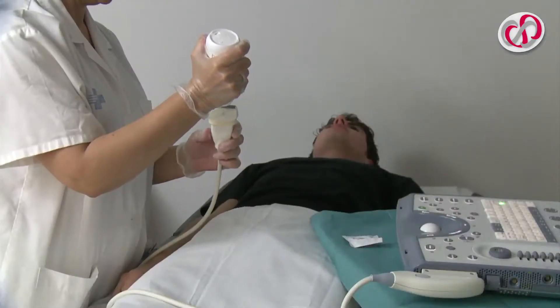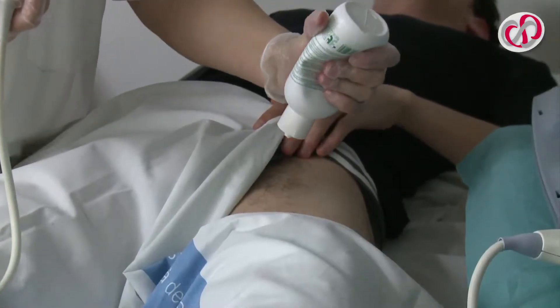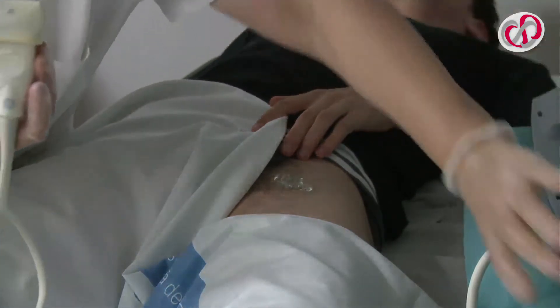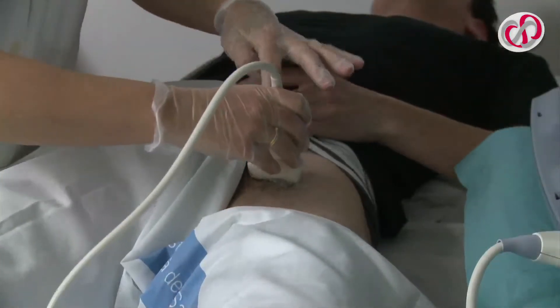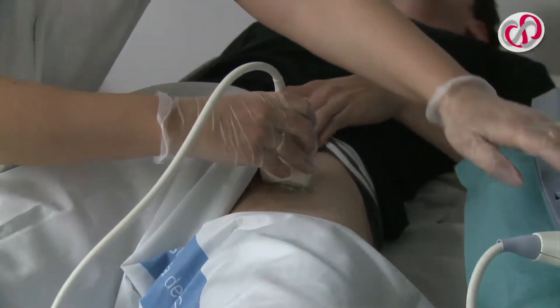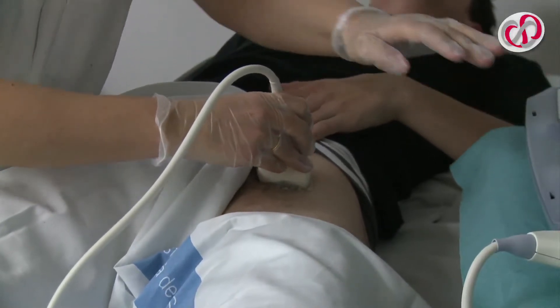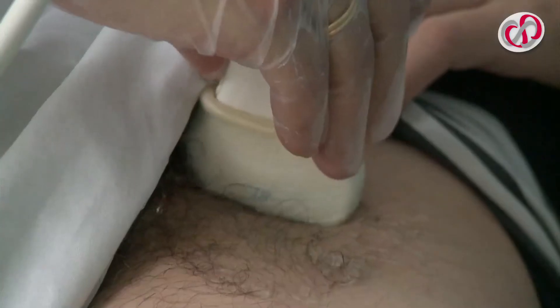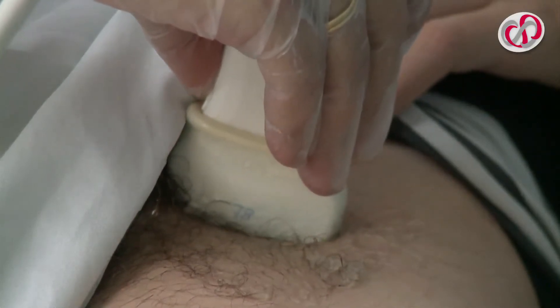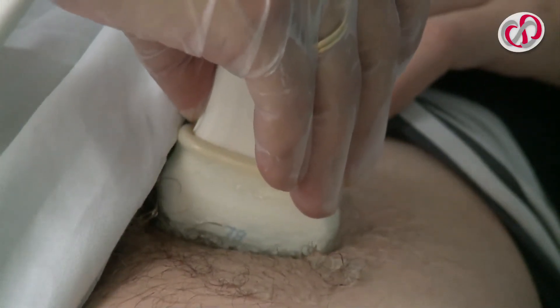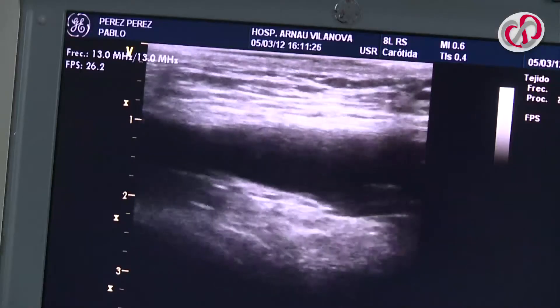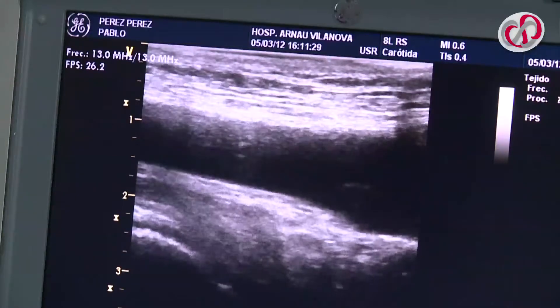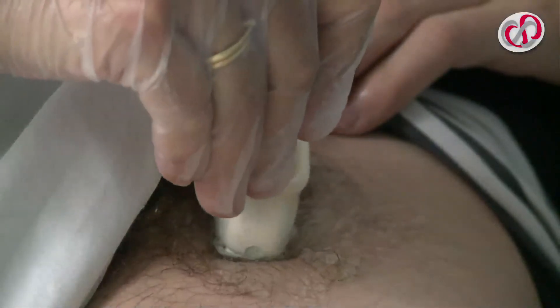Conducting gel is extended over the surface of the protector and/or the area to be explored. The femoral artery is located by placing the probe in the axial position over the artery. Once located, the exploration continues as far as the bifurcation, checking the morphology and the presence or absence of plaques.